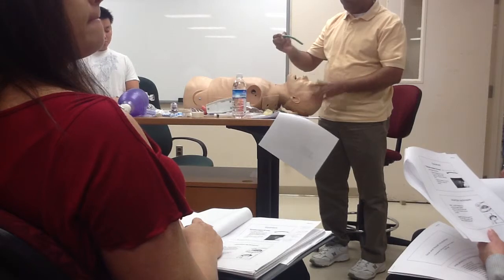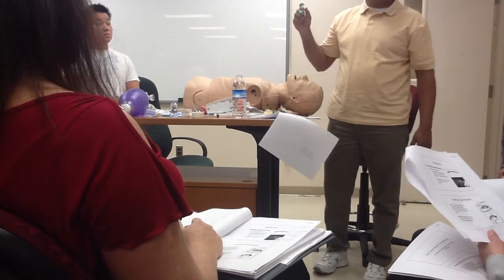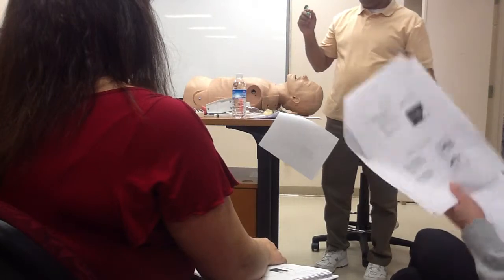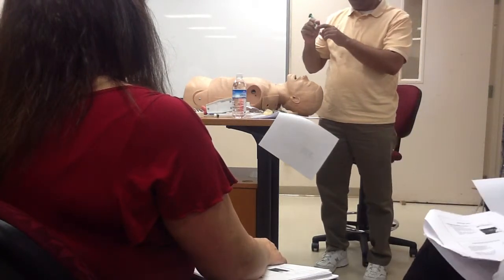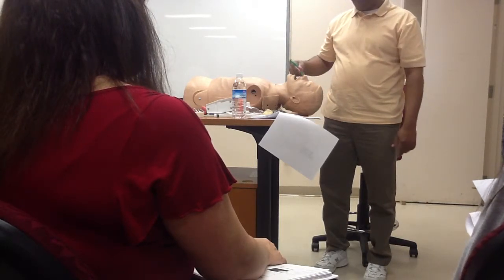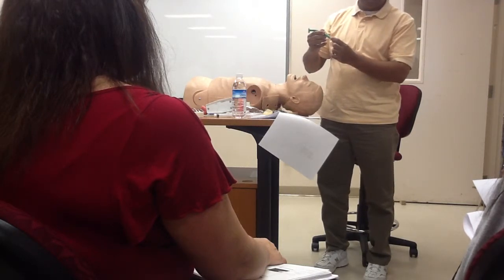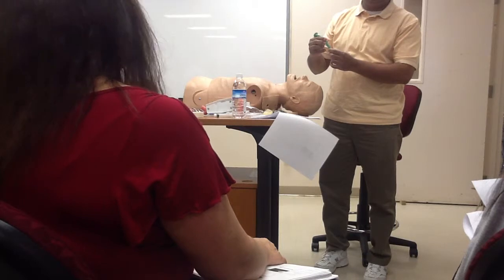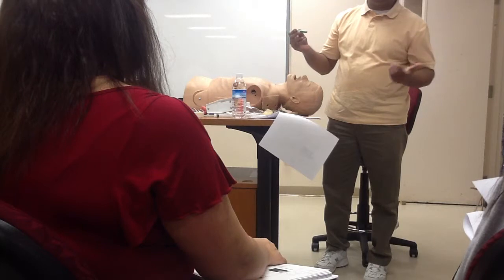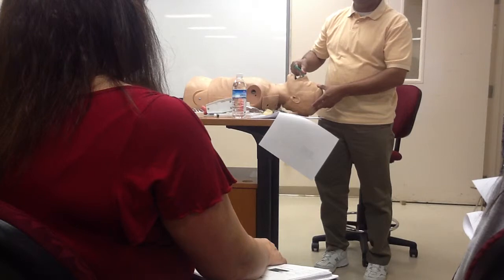I know what you're saying. Flat part towards the septum and then follow it in. That became a very big issue last year, doing the checkoff in the lab. Kathy Wallace usually says that this side should be on the side of the nasal septum and put it in like that. But the problem is if you're putting it in the left side, how do you put it in? You have to go upside down first, then turn and all that stuff. If you wanna do it like that, it's okay, but it gets complicated. So we just tell them, like the book says, just follow the natural curve.